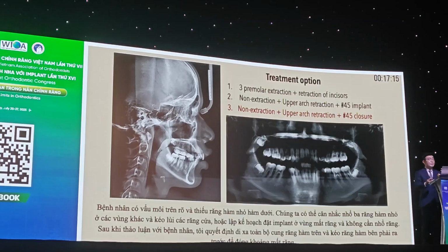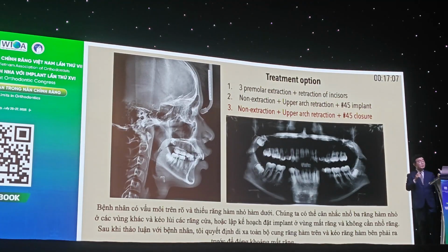After discussing with the patient, I decided to move the entire maxillary dental arch backward while advancing the mandibular right molar to cross the missing space.